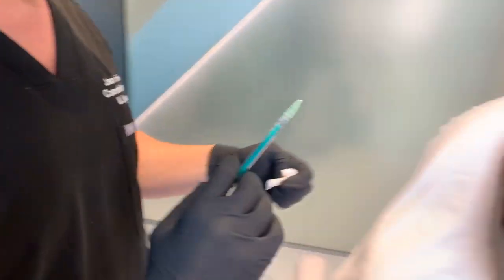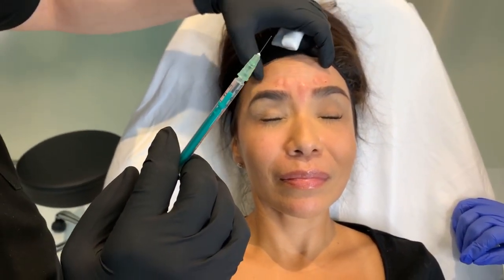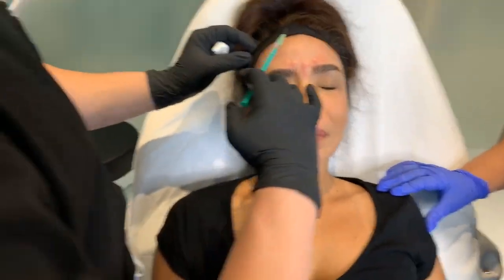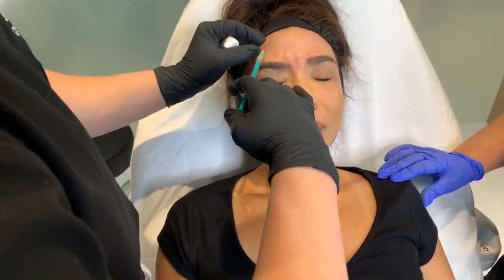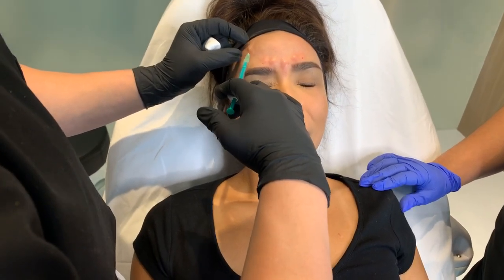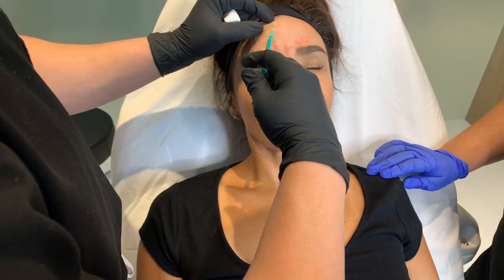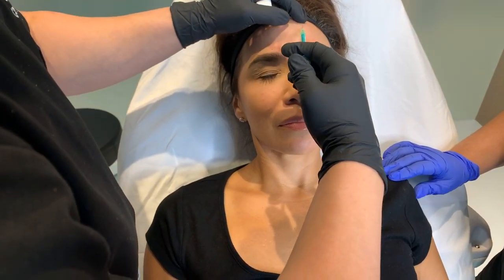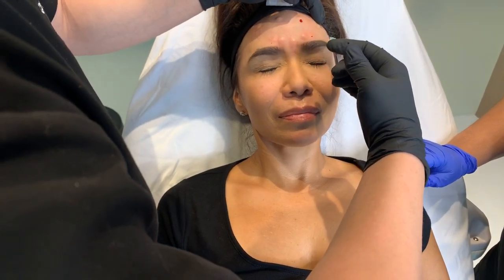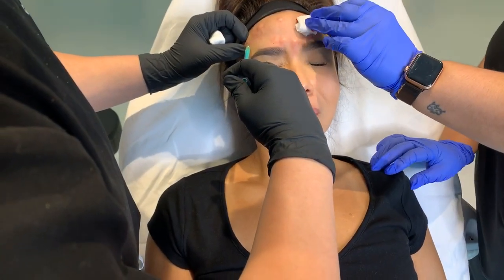So raise up again. Now, I like to keep her having a nice arch, but if you go more to midline, this is gonna arch away too much. It's gonna like this. So relax, raise up again. Good, relax, perfect. So we're just gonna do a small amount, a little bit on the tail. Raise up again, relax. We're gonna go a little bit high, small amount. I call this baby tox. So we do just little doses to just keep it nice and even.